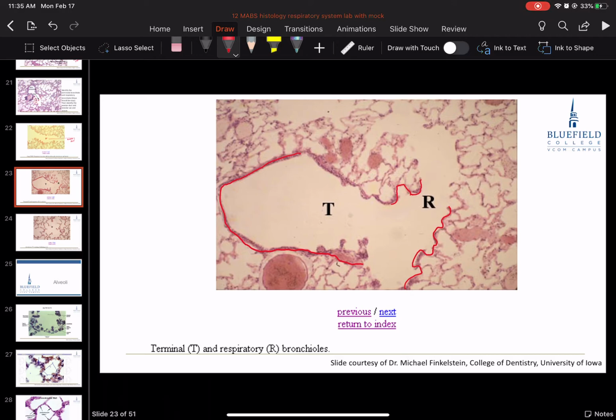Don't show it real well, but I get up here, I don't see the thick anymore. I'm probably getting into an alveolar duct as I get up here, but it's coming behind the screen or in front of the screen at that point.